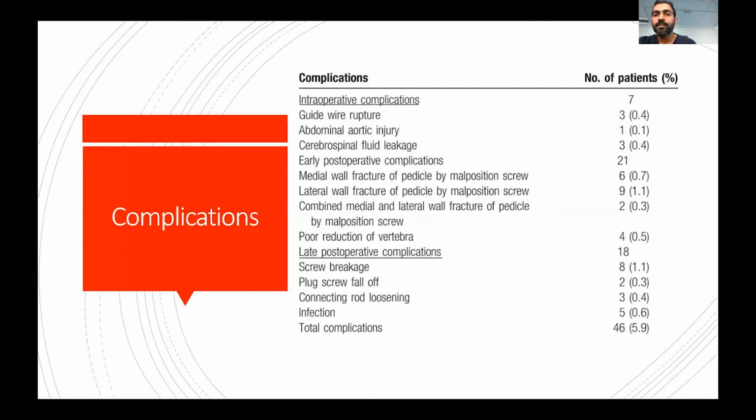Now we have advantages, but also there are a few complications associated with this technique. These are the intraoperative complications, the early post-operative complications, and the late post-operative complications. The intraoperative complications are the guide wire rupture, the abdominal aortic injury, and the cerebrospinal fluid leakage. The early post-operative complications are the medial or lateral wall fracture of pedicle by malpositioning of the screw, or combined medial and lateral wall fracture, or poor reduction of the vertebra. Late post-operative complications are screw breakage, plug screw fall off, connecting rod loosening, infection.